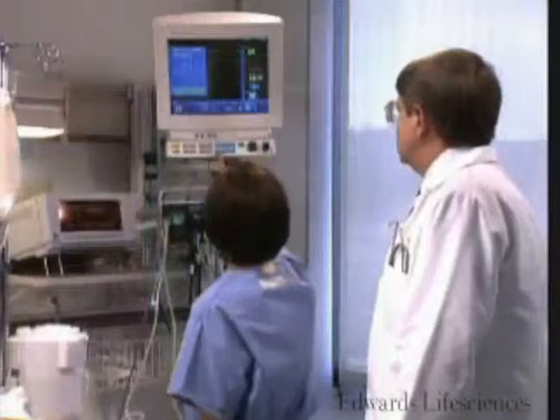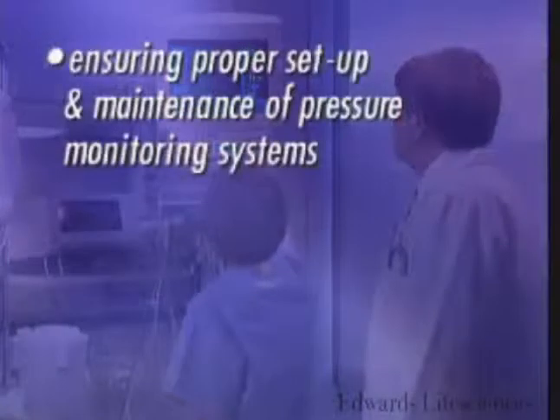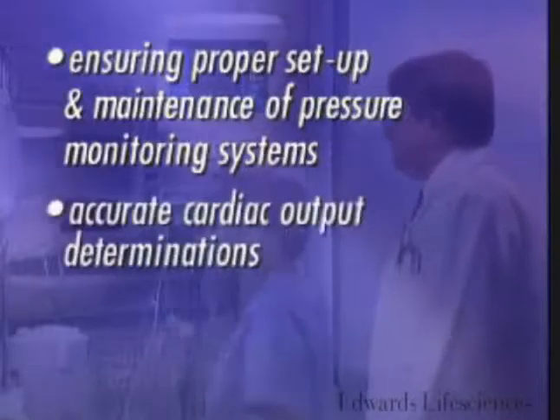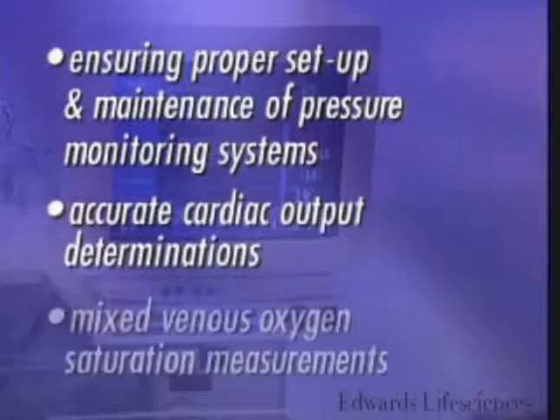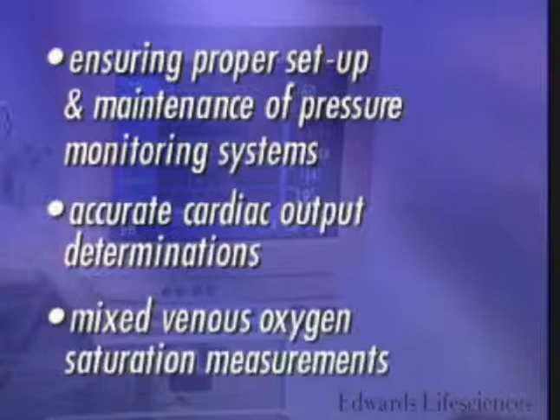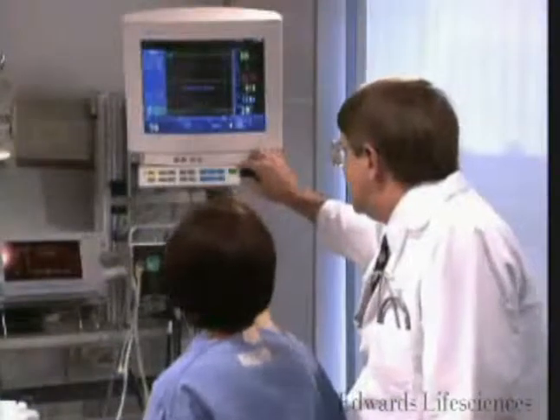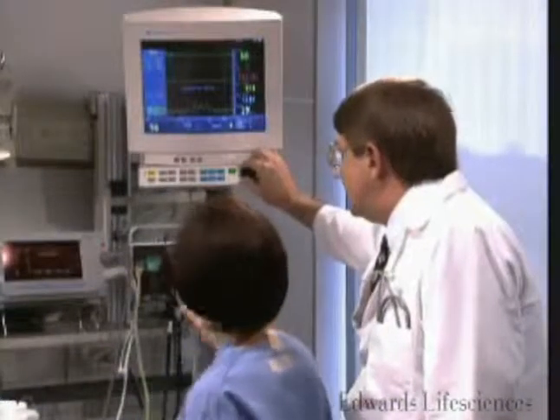Obtaining accurate hemodynamic measurements requires ensuring proper setup and maintenance of pressure monitoring systems, accurate cardiac output determinations, and mixed venous oxygen saturation measurements. In summary, a wide variety of valuable hemodynamic parameters can be acquired through the judicious use of pulmonary artery catheters.